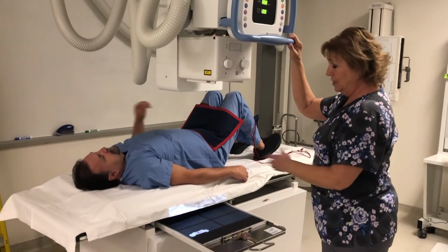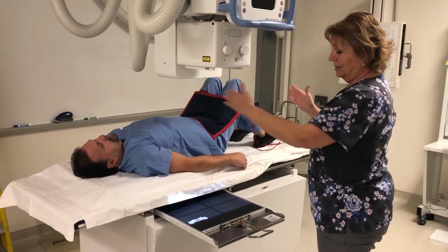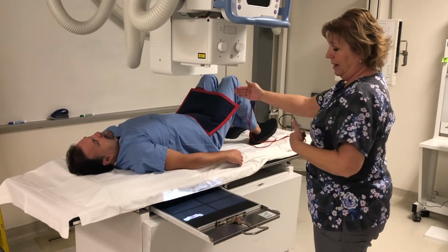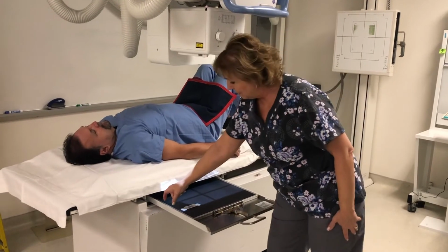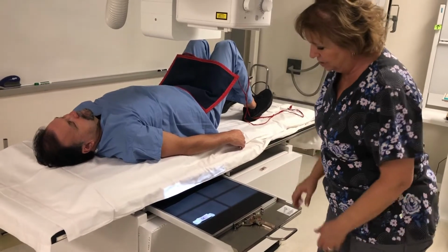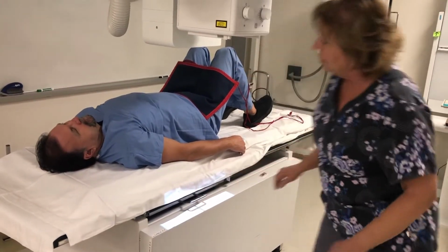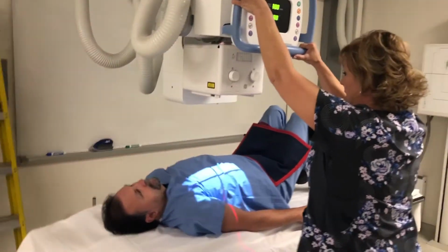All right, so your collimation for the thoracic spine is the same as it was for the L spine. It's 17 inches by 7 inches. Pretty much the spine just goes right down the center, so you can place your marker anywhere along the edge of the outside part of the field of view. Align the detent.